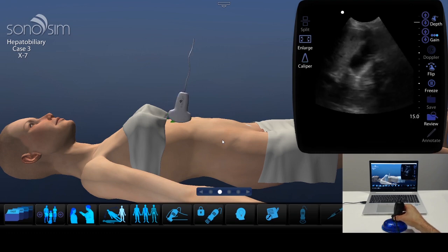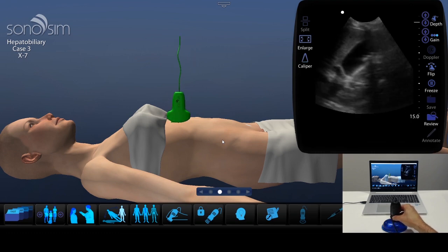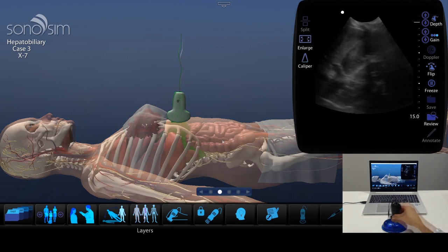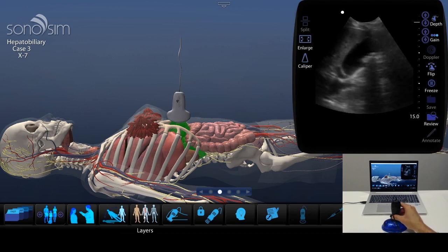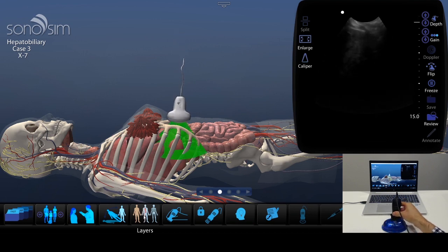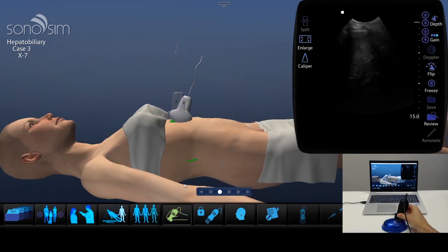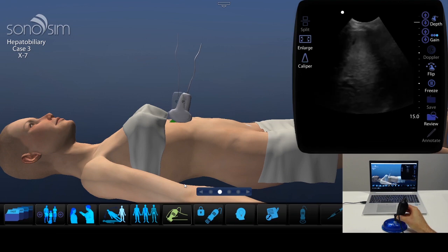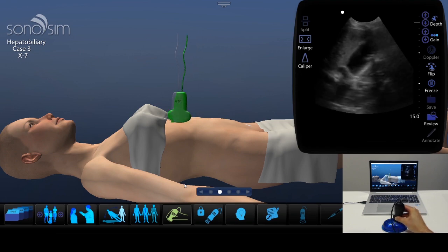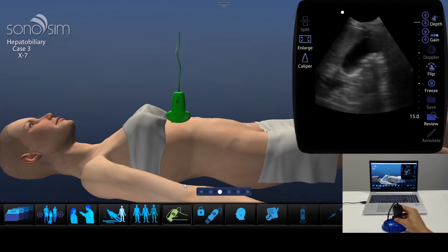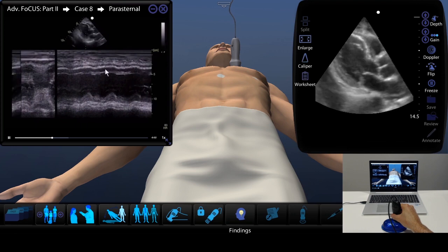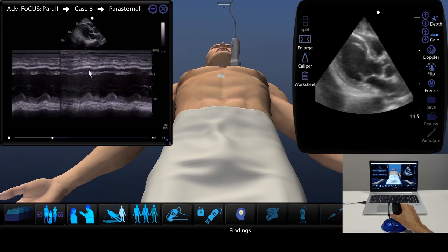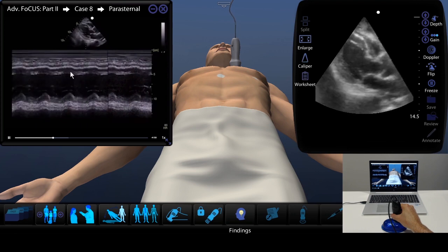The Sonosimulator has a variety of built-in training tools. You can remove body layers to see how the ultrasound beam transects the underlying anatomy. The probe guide helps with probe positioning and acquiring the most optimal image. Findings videos provide an ultrasound expert who serves as a virtual tutor to assist with interpreting the scan.